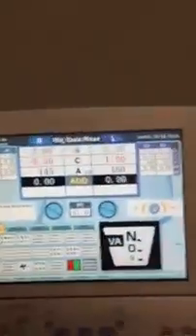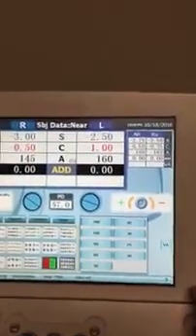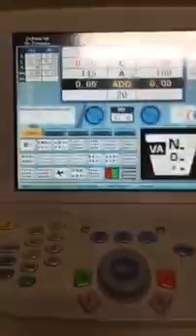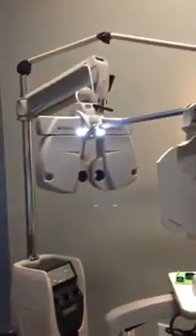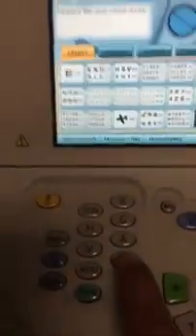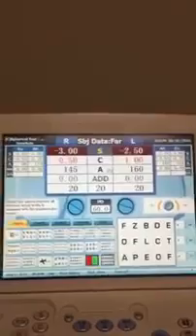Okay. Now, once they read the lowest line that they can, and it's binocular, you can go ahead and press VA, and then pick what their vision is, and let's say it was 20/20. Okay. So now that it's 20/20, the next thing you do is press set, and it says, do you want to quit the course? You put yes, because we're all done. Okay, if you want to go back and turn those lights off on this Phoropter, you press F and N. That's far and near, and it'll go back to the far prescription and the distance PD.